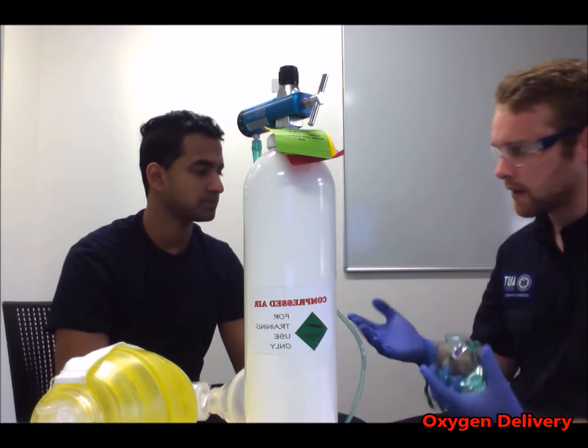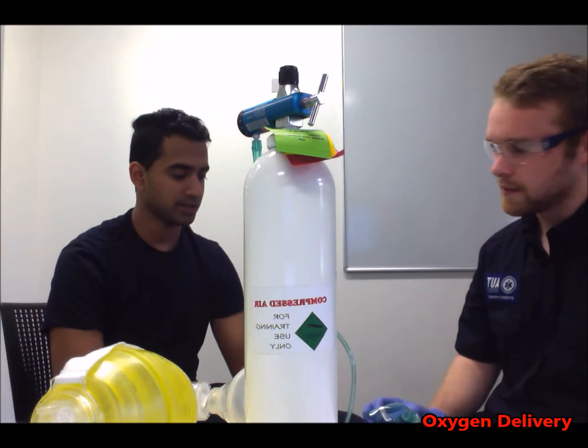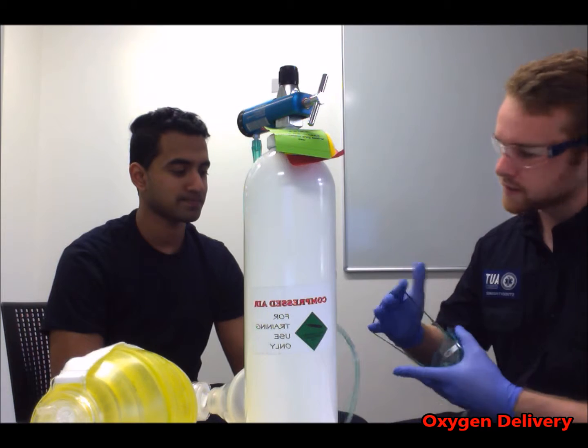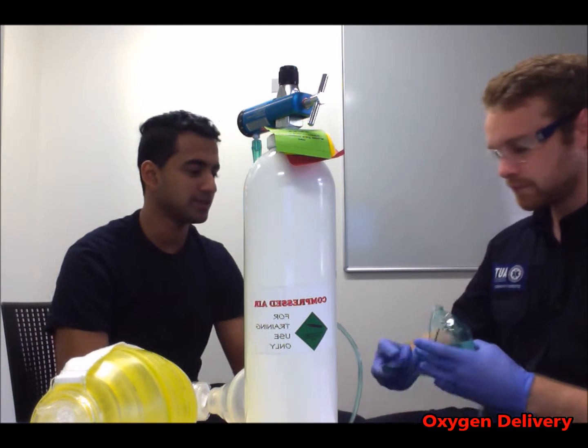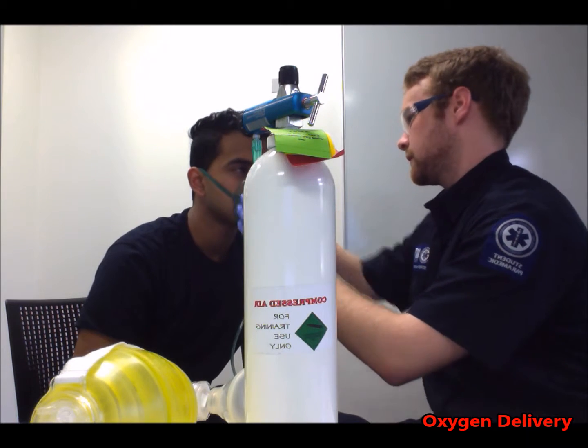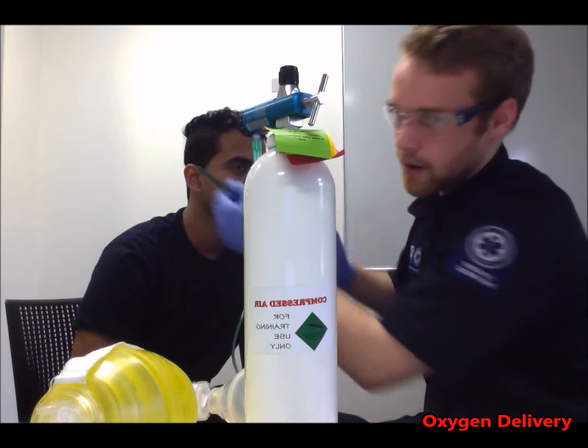So Dave, I see you're experiencing shortness of breath, just a little bit. What we're going to do is I'm just going to place this mask over your face and we're just going to give you some oxygen. Is that alright? Yes, thank you very much. So I'm just going to place this over your head, not on the ears. That's fine.